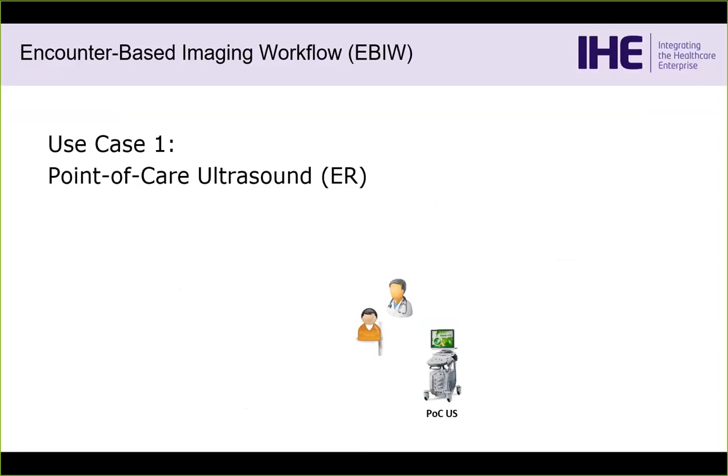They pull that over. Perhaps they scan the wristband of the patient. That's going to be the start of the chain. So from the patient, whether it's a name, whether it's from the wristband, the patient ID or the admission ID, you've now got a hook to go get the rest of the metadata that you need. We want to avoid entry by the person operating the system.